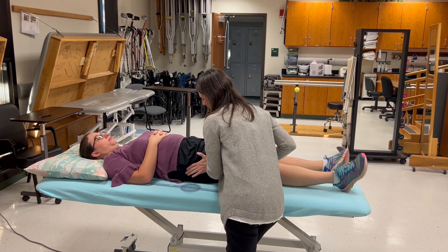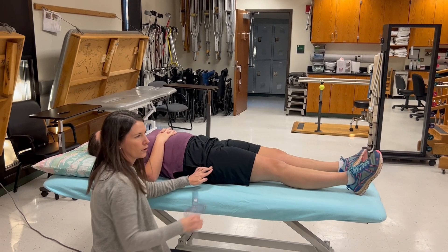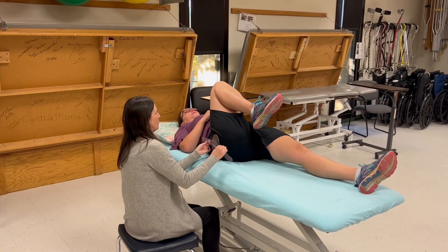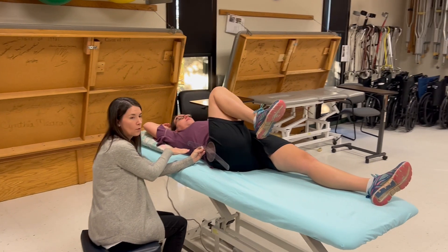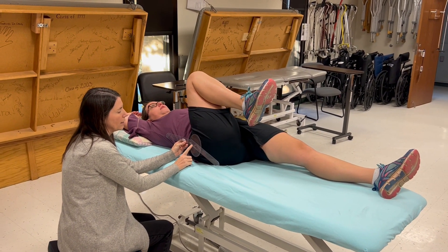I'm going to keep my fingers on the greater trochanter and give her a cue to bring her knee to her chest. Then I place the fulcrum over the greater trochanter. The stationary arm has nothing to do with the lateral midline of the thorax — it has to do with being parallel to the lateral midline of the pelvis.